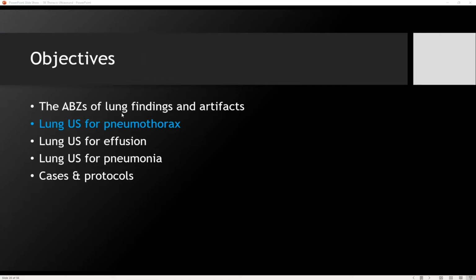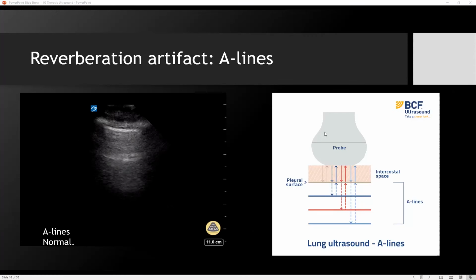Any thoughts or questions about this so far? There's a question from Helen, who doesn't have a mic. Oh, perfect. Thank you. Sorry, I see it now. Thank you. Sorry, I don't have a mic. Why does the probe think it takes longer for the return signal in A lines? So thanks, Alan, for the question.